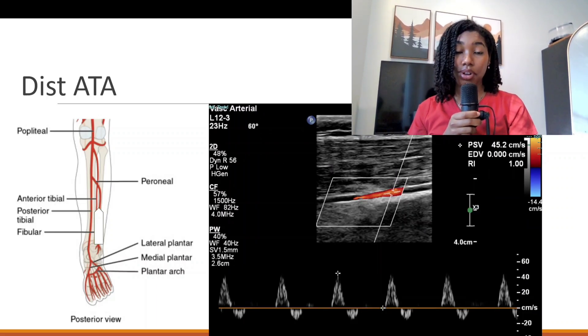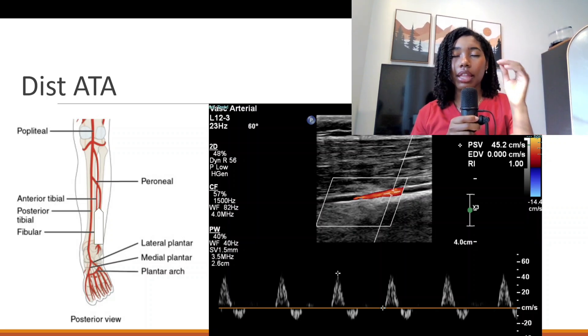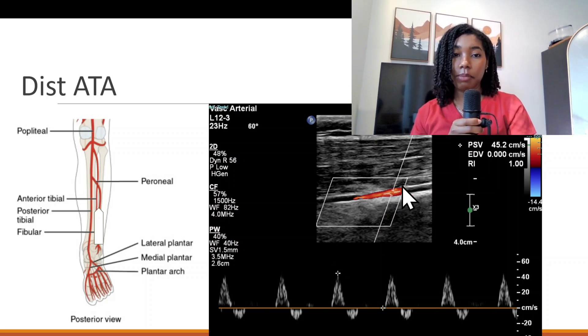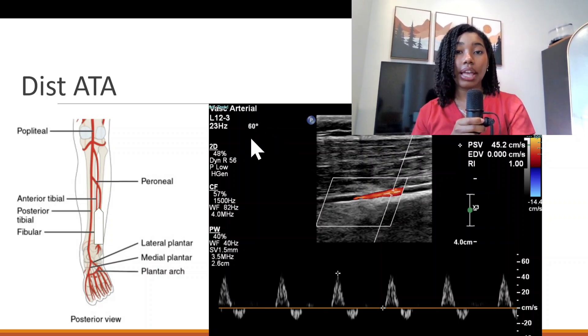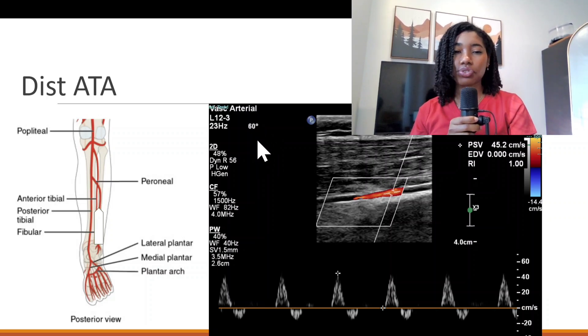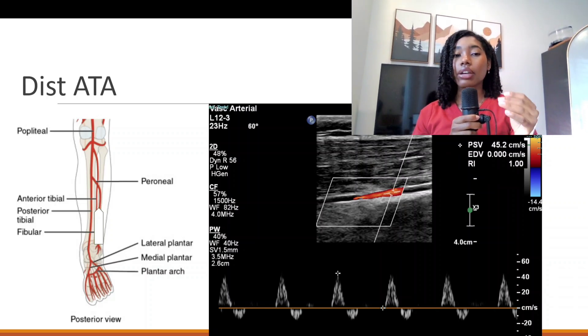One important thing throughout the exam: make sure the angle correction is parallel to the walls of the vessel — it should not cross the vessel walls in an X shape but run parallel in the middle. Keep the angle at 60 degrees as much as possible; you can use 45 degrees, but with lower extremity arteries 60 degrees is usually sufficient. You should also be able to steer the beam and the color box to maintain that angle if necessary.